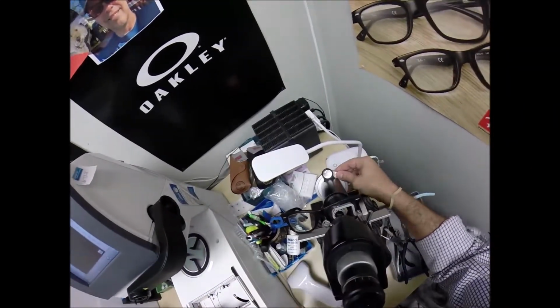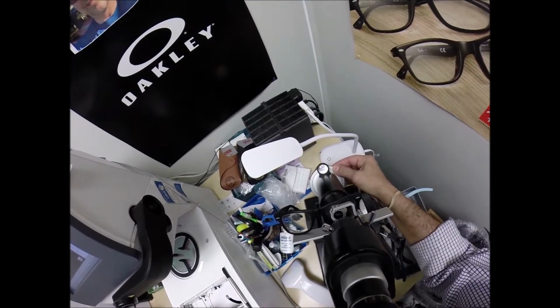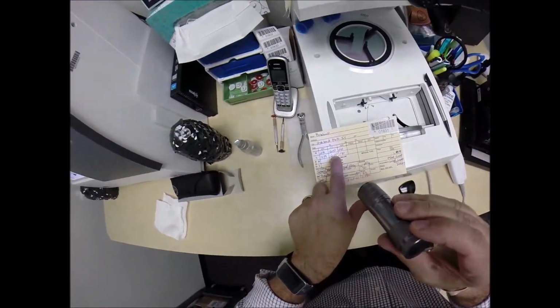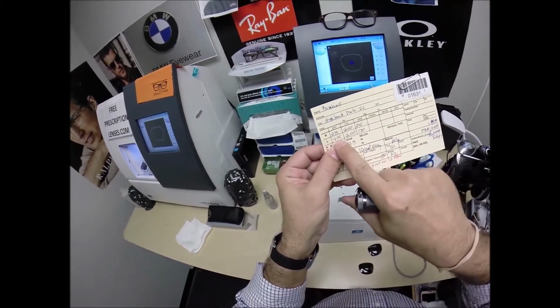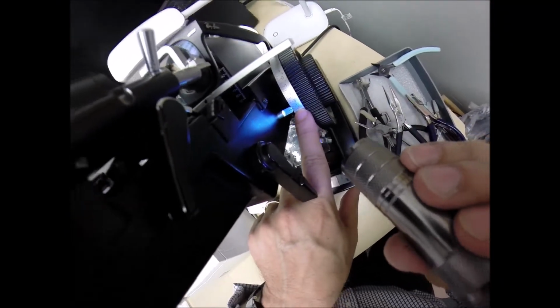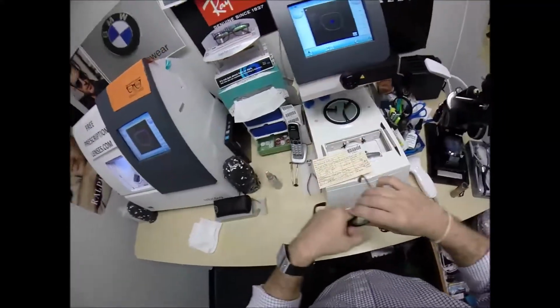We have to turn the fine tune knob. So you're at 10 here, 180 is 0. Turn it to 170. Check the power, and I'm getting minus 1.75, one tick mark away from 2. Minus 1.75. Now 2 diopters. Remember high school algebra, if you add two like signs together? Yeah, me either. But if someone borrowed $1.75 from you, then they borrowed another $2, they would owe you $3.75. Let's check the second power. $3.75 in the red, one tick mark away from 4. Man, the guy with the two thumbs and the bad jokes, he knows what he's doing.